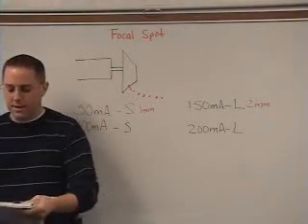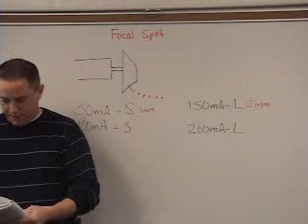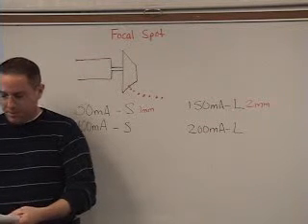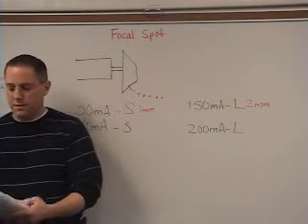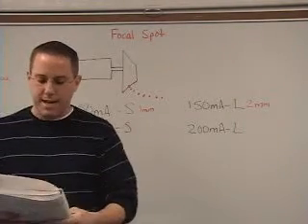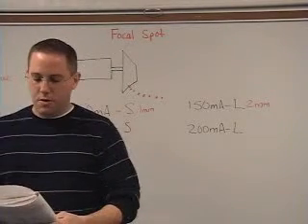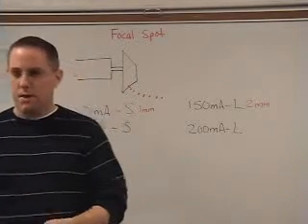They're showing angling the x-ray tube and how that can affect the way the picture turns out. At the end, the summary on page 111 kind of summarizes most of what we just went over. It tells you what contributes to the density. It says a high mAs, a short TFD, a low grid ratio all affect your density. Also, it says a small field size.